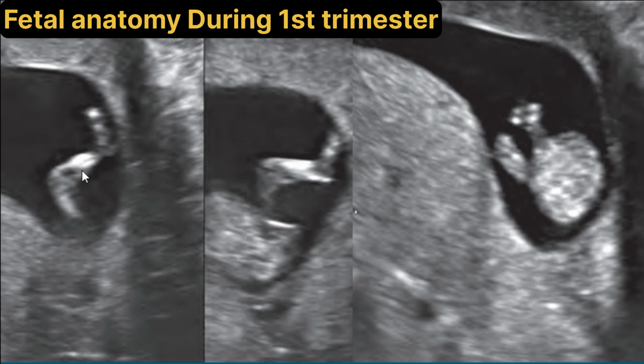This one is the left leg of the fetus and this one is the right leg of the fetus. And here we can clearly see that this is the thigh of the fetus, and these two echogenic lines are tibia and fibula of the fetus. And here we can see the foot of the fetus that is visualized clearly in the sonogram.